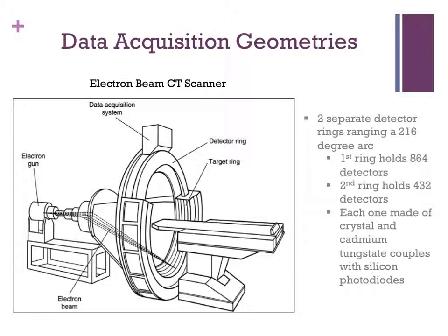The data acquisition system consists of ADCs, which are also known as digitizers, and they sample and digitize the output signals from the detectors. The digitized data is stored in random access memory, which can hold data for hundreds of scans in the multi-slice and also in the single slice modes. All of this information is then sent to the computer for processing.